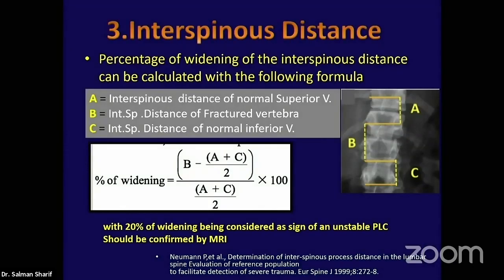Now, the percentage of widening of the interspinous distance can be calculated with the following formula.